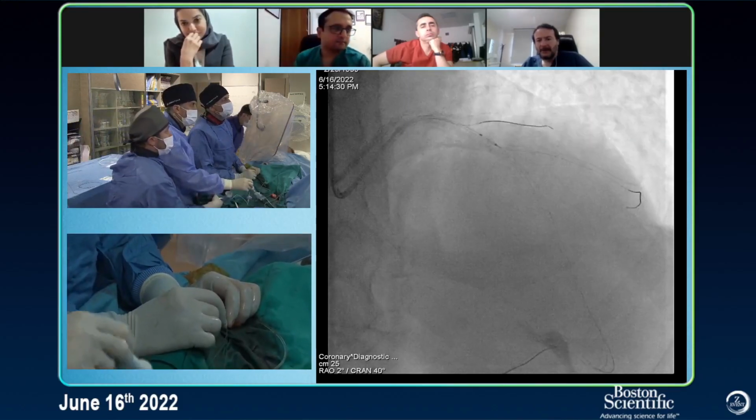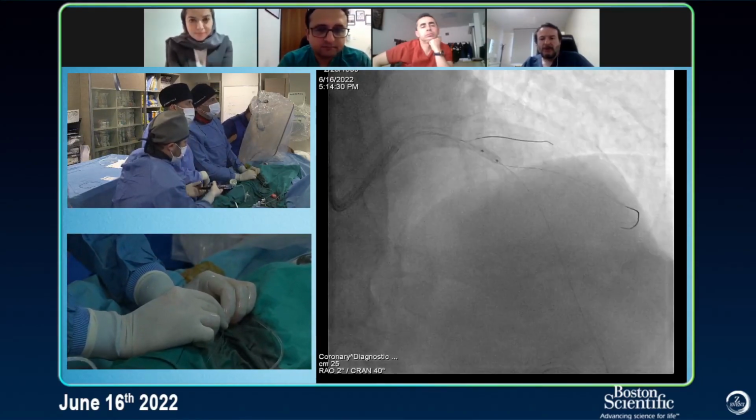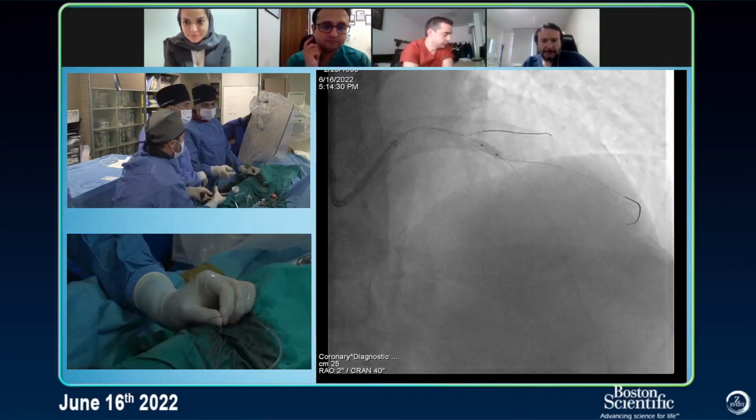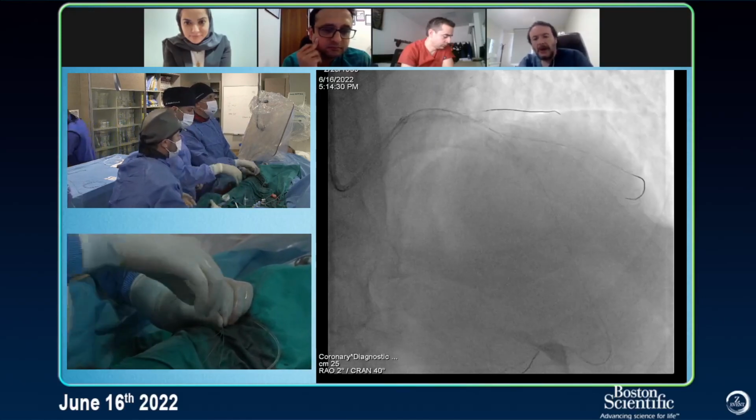Maybe from diagonal. 12, 14. Yes, we need to have... The ideal option is always off the table, I think, for me here, right, guys? Yeah, this is good. 40. Okay, let's see. I think it's okay now.